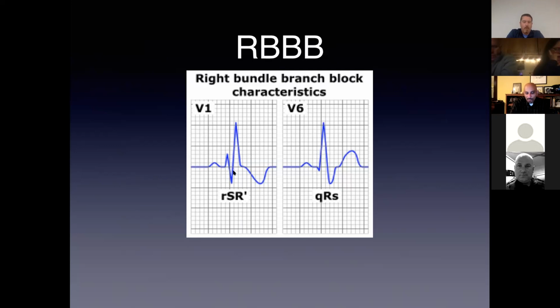When that's towards the right of the patient, then that's going to be a right bundle branch block. And when you look at it in V6, the beginning part's going fast, the end part is going slow. So V6 is over on the left side. That's why this is negative, because the right side of the heart, opposite of where the lead is, is the part that's depolarizing later, because that right bundle branch is blocked.